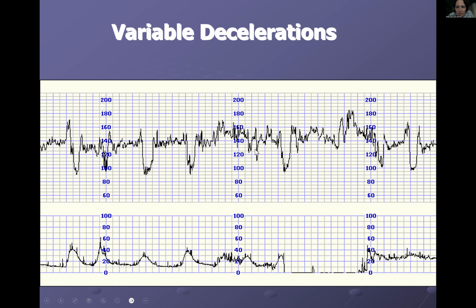Now, as you are progressing, with these ones over here, there has been a bit of a loss in the trace when it comes to the contractions, or maybe a change in the baseline for the contractions. Here you can't tell. They look variable, but you need to continue monitoring because we don't know the relationship with the contractions. Also, you need to adjust the belt in order to make sure that they are not becoming more of a late component.